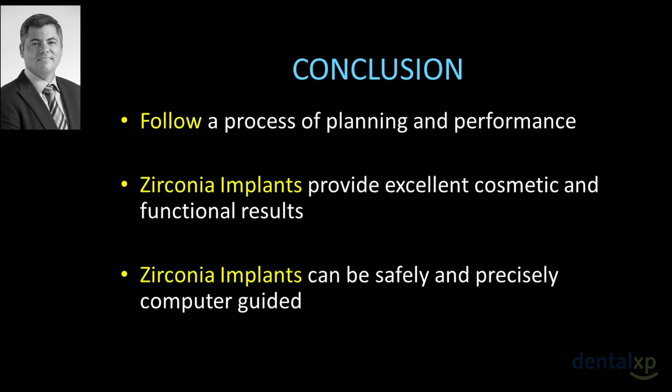Our conclusion is that for any type of procedure in implant dentistry, you need to follow a process of planning and performance. The zirconia implants will provide excellent cosmetic and functional results. They are very strong. The zirconia implants can be safely and precisely computer guided, utilizing different implant systems, and in this case they were computer guided utilizing the Simplant Universal Guide.